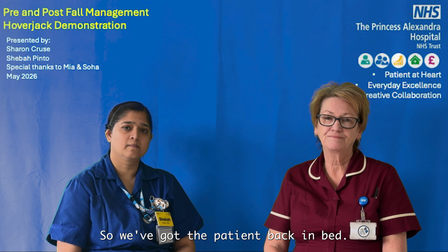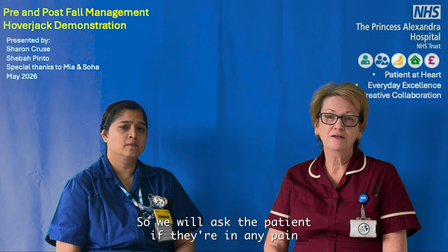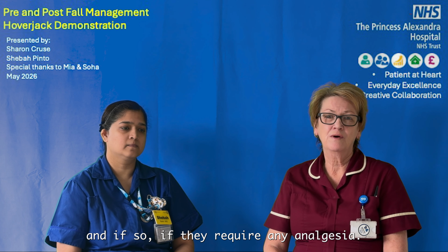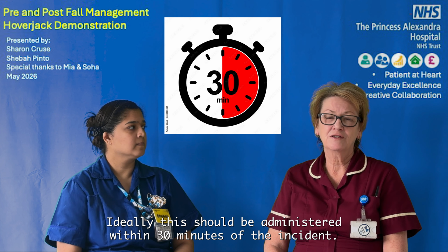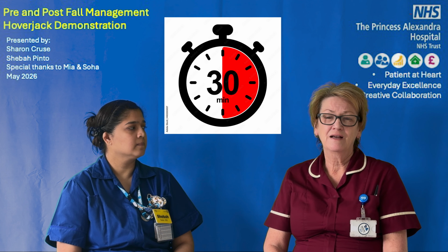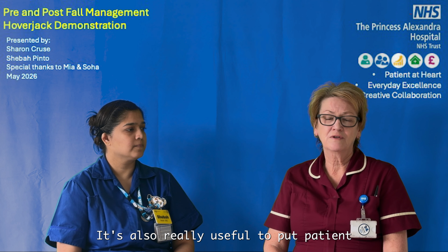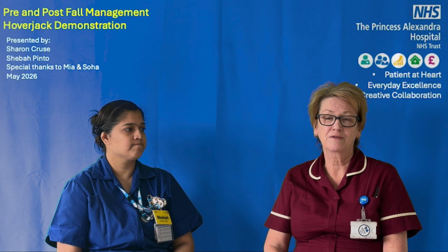So we've got the patient back in bed. Are there any administrative processes that we need to carry out? We will ask the patient if they're in any pain, and if so, if they require any analgesia. Ideally, this should be administered within 30 minutes of the incident. If they don't require it, or they decline, it's also really useful to put patient refused on the drug chart, which is on our Excel.